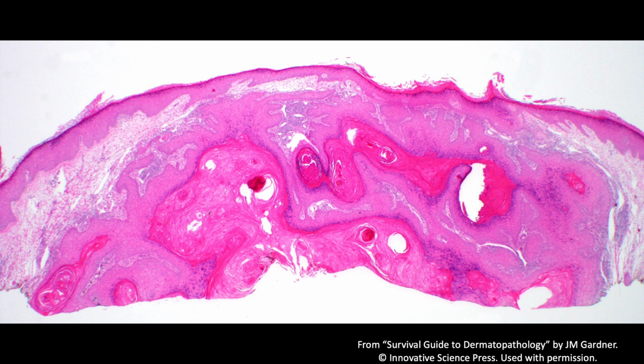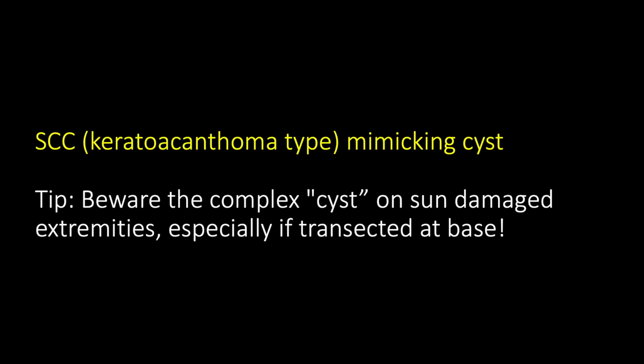There's not much atypia, but it's complex. I can't see the base. If there's concern clinically or if it persists or recurs, please excise it or repeat biopsy. That's how I handle those. This I would probably just call squam keratoacanthoma type on the diagnostic line in my practice. Others may do it differently.